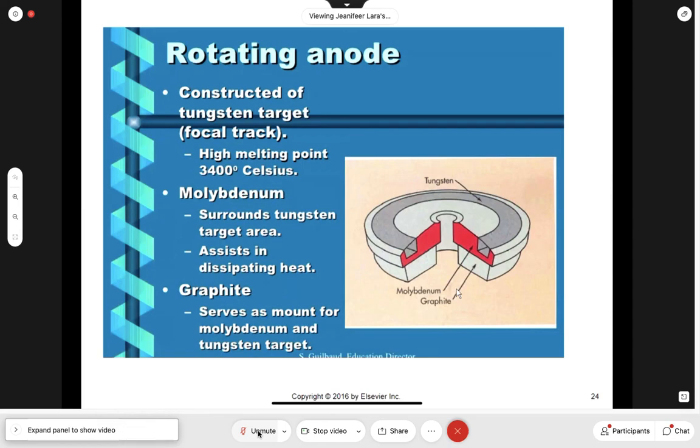It's not just the two connections. It's all separate, because you have a connection to the filament and a separate connection to the focusing cup. You have a connection to the induction motor, to the stator, and then you also have a connection to the anode disc. So it's almost like you're making the anode disc supercharged. You have nothing to do with the stator and the rotor. That's what happens in phase two. Correct. That's electrified in phase two.